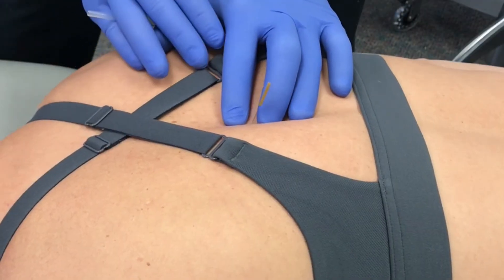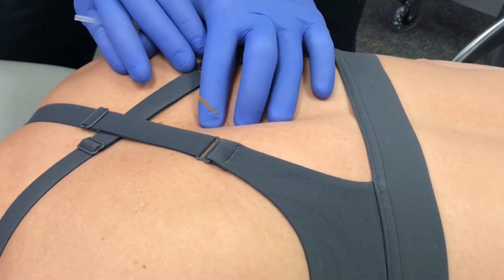If you haven't come up to the subcutaneous tissue, though, you'll see that your needle will bend and not move out of the muscle that you're still in.